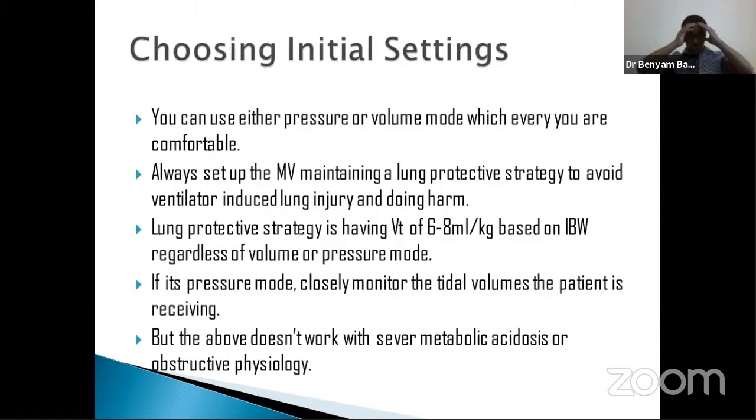So let's go to the choosing of initial settings. Basically, there is no recommendation that prefers one mode, pressure or volume, over the other. It depends on where you are, what mode you are comfortable with, and what factors you want to manipulate. For example, if I want to manipulate tidal volume, I would prefer to start with volume.